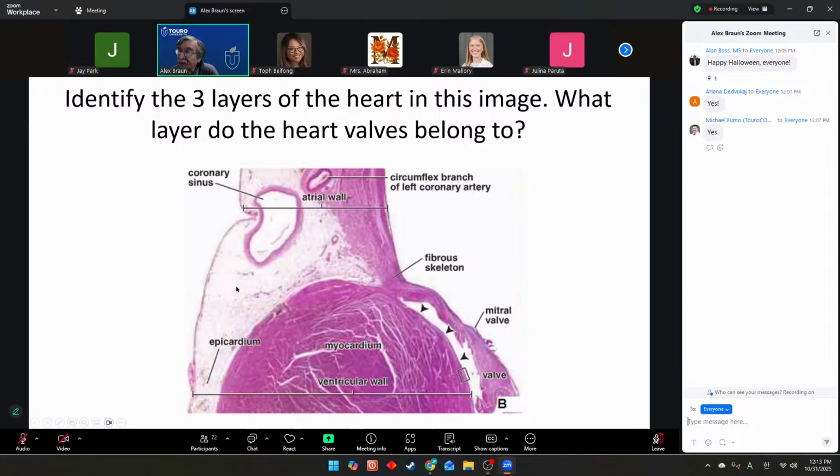Of course, there will be some areas where there's less fat and more collagenous tissue in the epicardium, but in this picture, the fat is quite prominent. There are blood vessels that travel over the surface of the heart before they send branches entering into the heart. So you're going to find coronary arteries and a variety of venous channels as well. Here we see a fairly large vascular channel, which is labeled coronary sinus. This is a vein, not an artery.